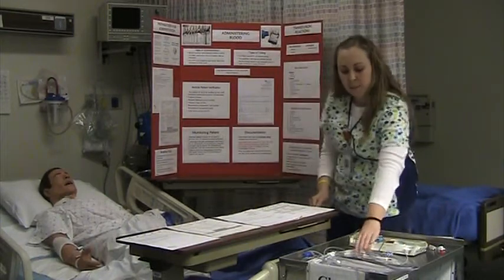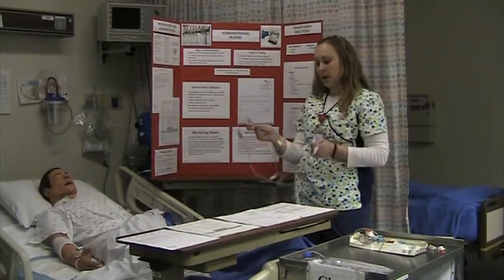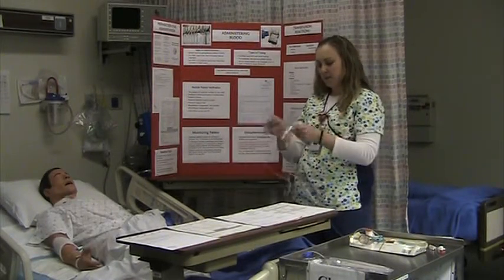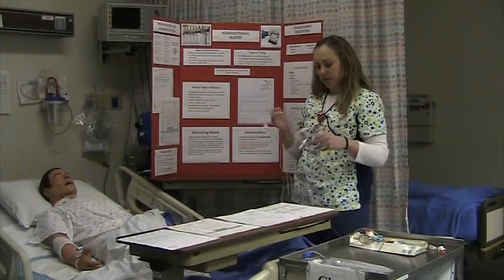Next is the FFP tubing. This is the tubing for FFPs. FFPs can go by gravity or on a pump, so we use this kind of tubing here on our Horizon pumps. And we start slow and then as fast as they can tolerate, okay?